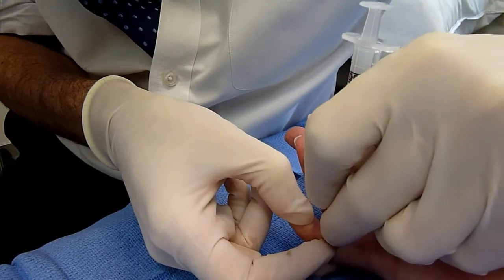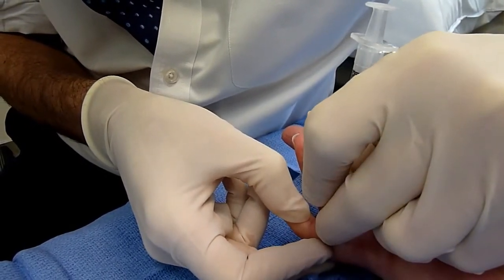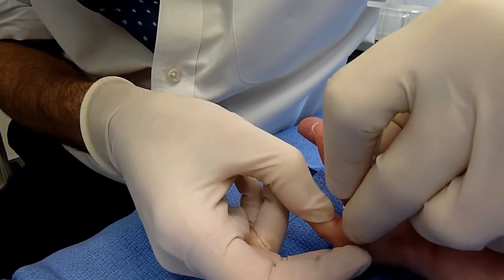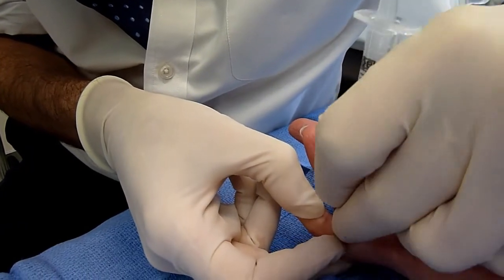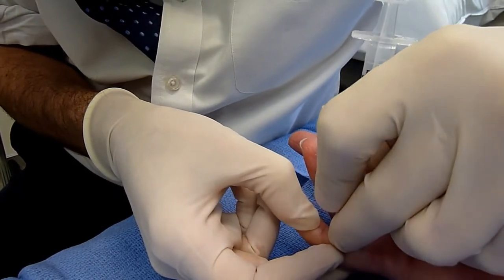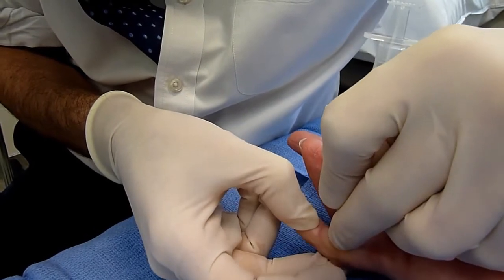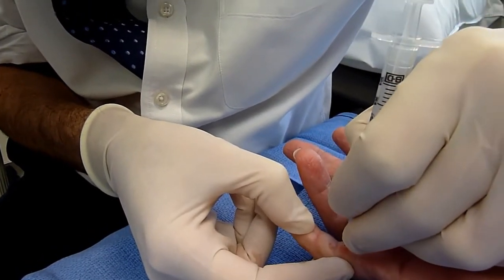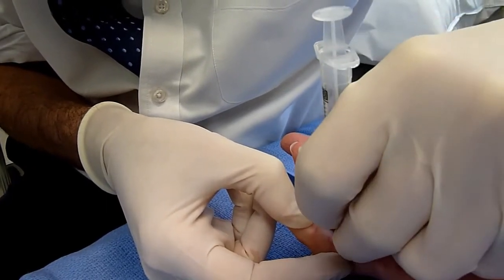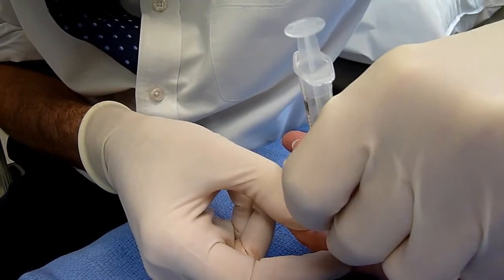So I begin, as you see here, most distally where the nerve is, and then I will slowly move proximally. When I worked with Charlie, what was interesting is he did this sort of sewing needle. You feel that? No. Where he goes up and down in the cord, and there's no doubt I do what they call the pendulum technique, where you go side to side. Back and forth. You see, it's the swipe technique.